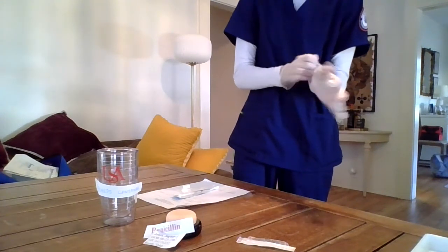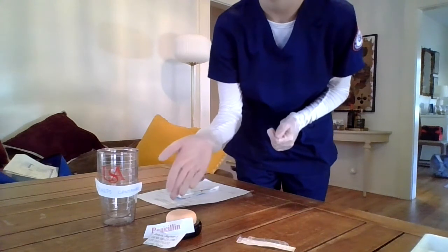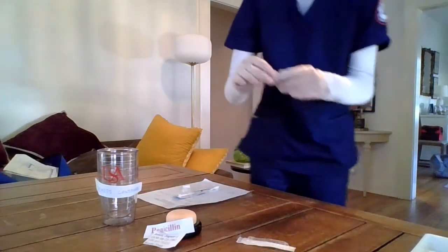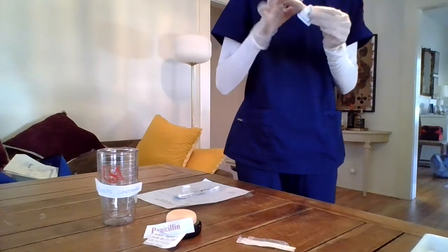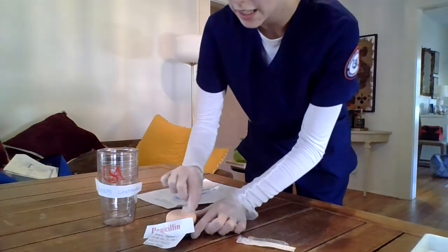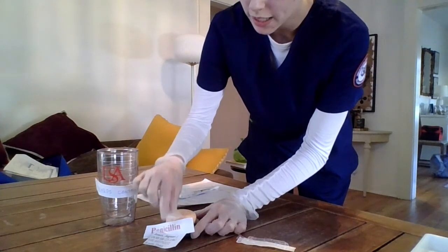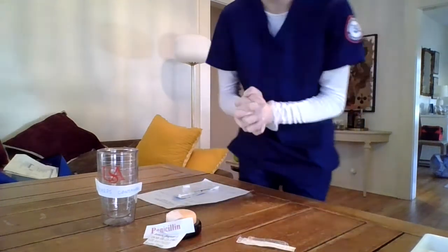So before I give my injection into the abdomen, I want to assess the integrity of the skin. I do not see any bruising, so we are good to go with administration. Before I give that shot, I want to be sure to cleanse the injection site with my alcohol swab pad. So you'll clean in a circular motion all around and leave one end of that pointed towards where you last cleaned, so you know where to give it.